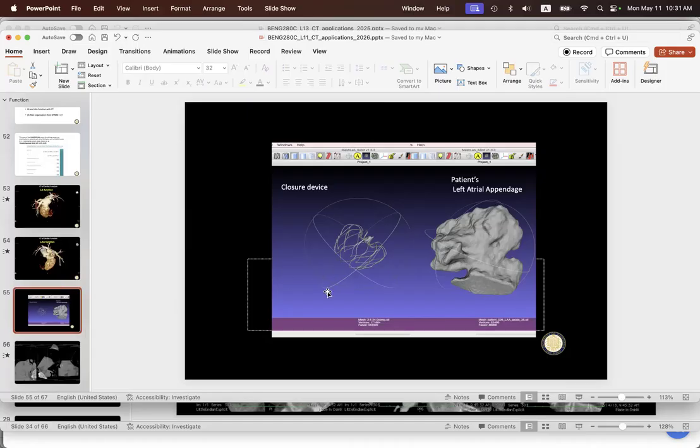But this whole thing can collapse down onto essentially a catheter, and you push that unit into the left atrial appendage, and then you pop it open such that it looks like this, and it opens to fill this gap entirely, right? So these struts hit the walls along here, and then you have essentially isolated the left atrial appendage from the rest of the left side circulation.